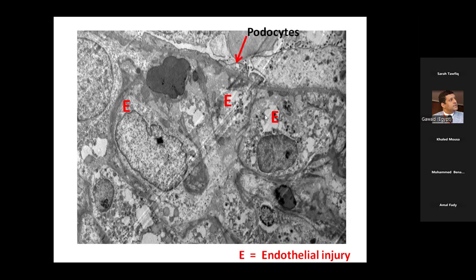I want to say something, that it's not always that clear for me. We can get confused. I know that you selected the most clear photos for us. Usually it's clear to differentiate between these, but sometimes it's not that clear. Sometimes you can get lost.